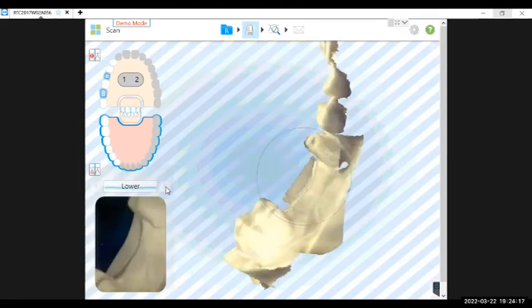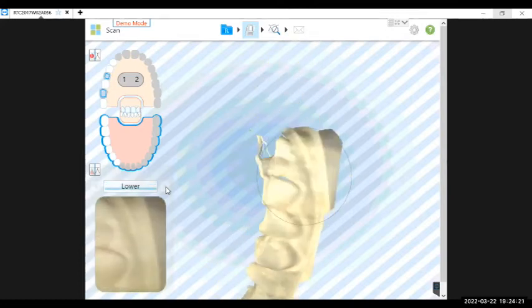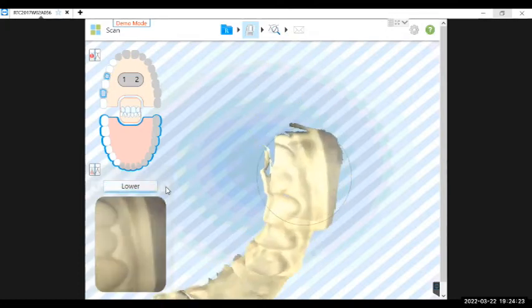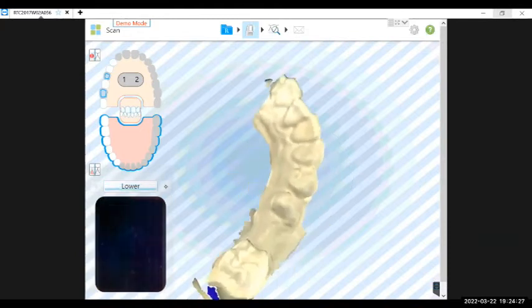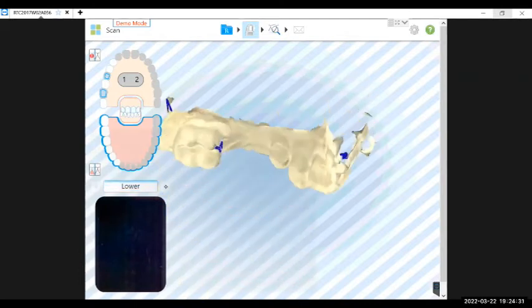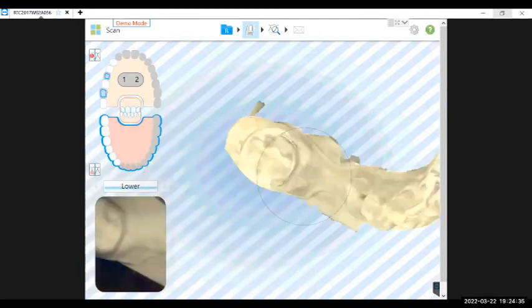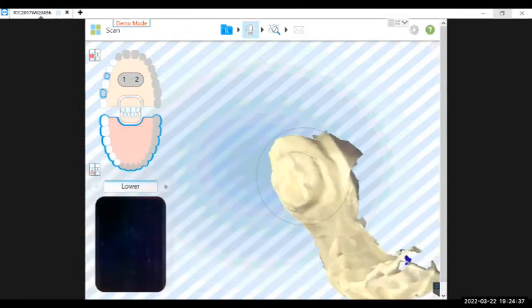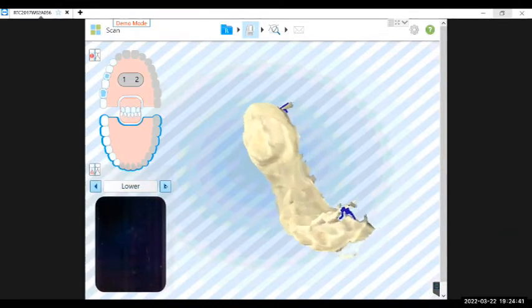And Brittany, while you're scanning, I'm just going to speak a little bit to what that could mean, right? So it could be that you're working 2 columns and you have an assistant that has one-on-one time with the patient. Doctor's running a little behind, and she or he could begin scanning before you ever come in and anesthetize the patient.